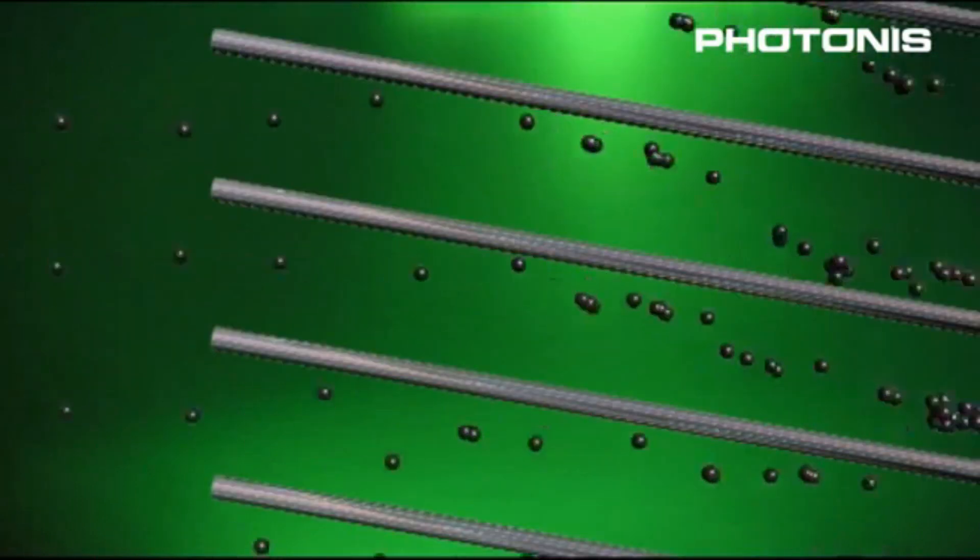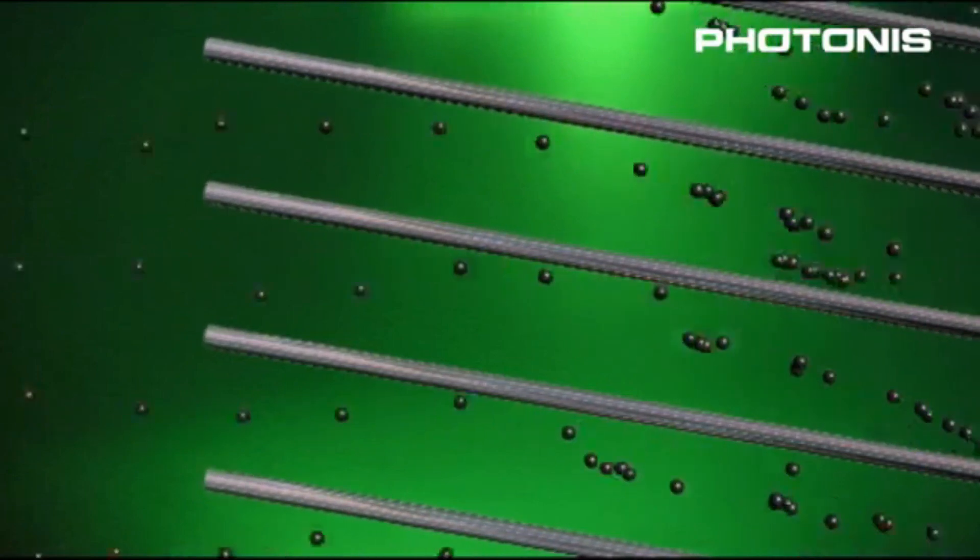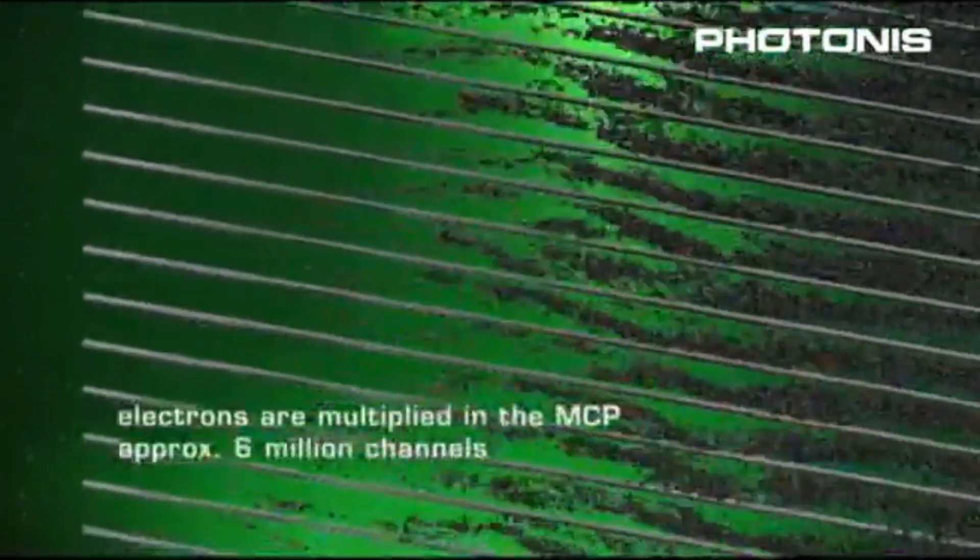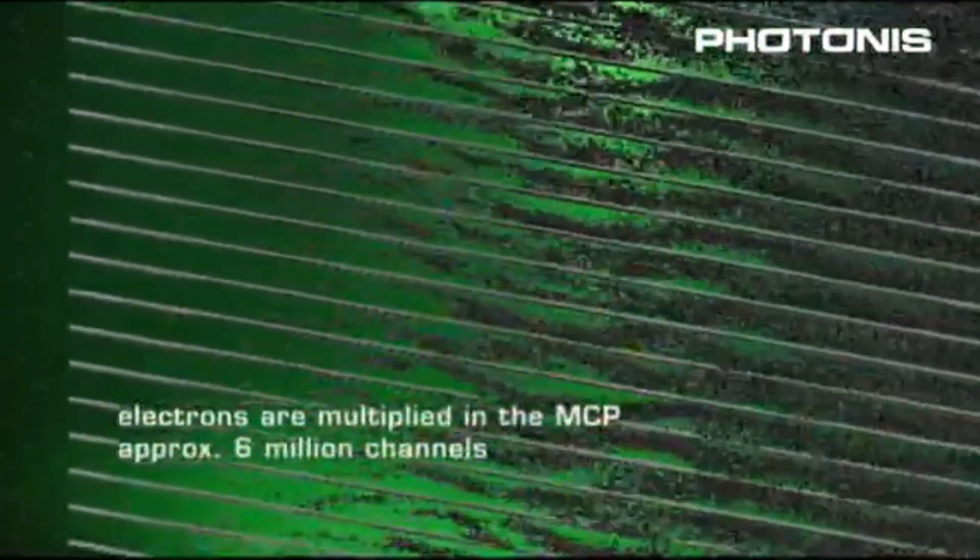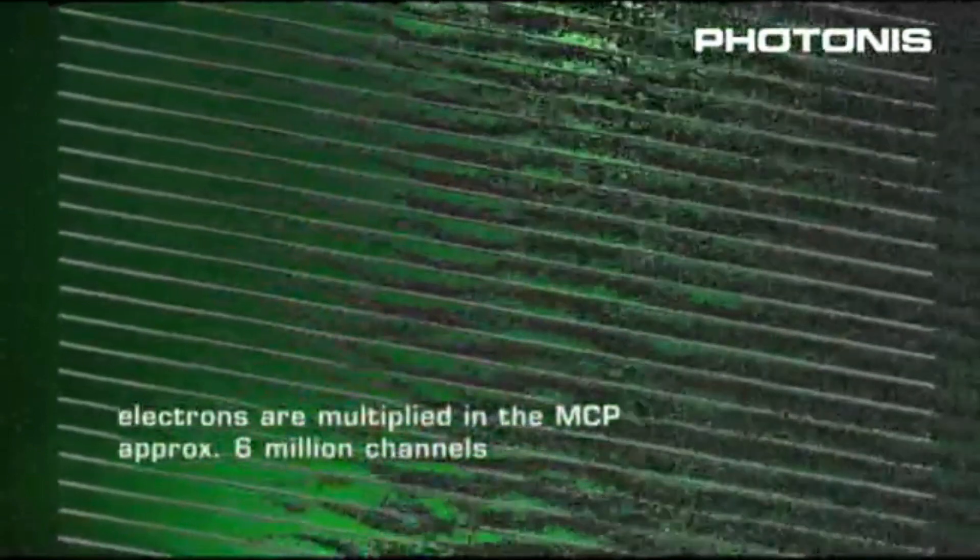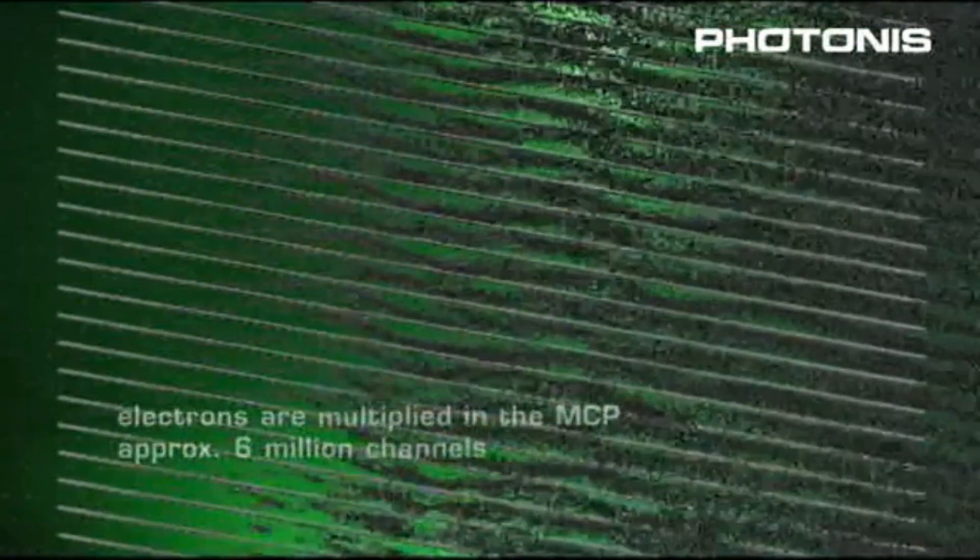Photons from a low-light source enter an objective lens which focuses an image into a photocathode. The photocathode releases electrons via the photoelectric effect as the incoming photons hit it. The electrons are accelerated through a high-voltage potential into a microchannel plate, or MCP.